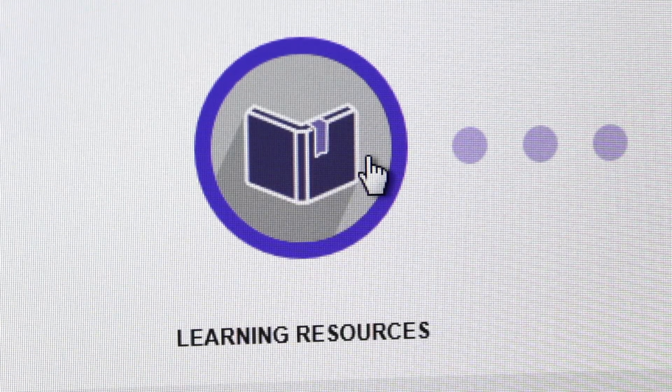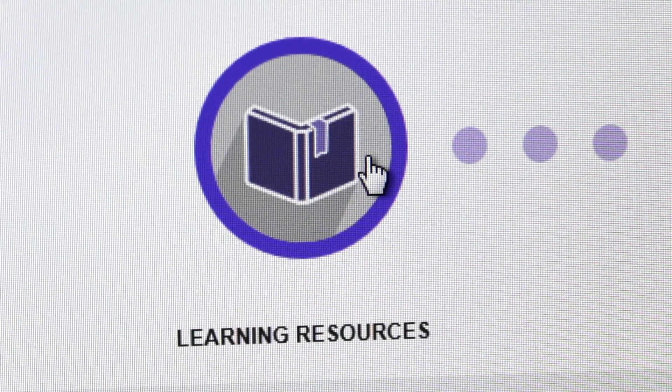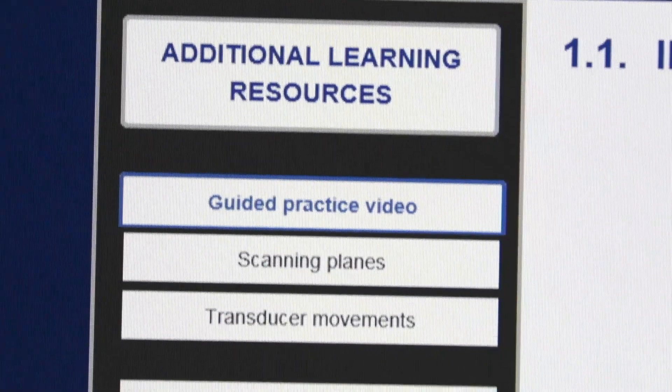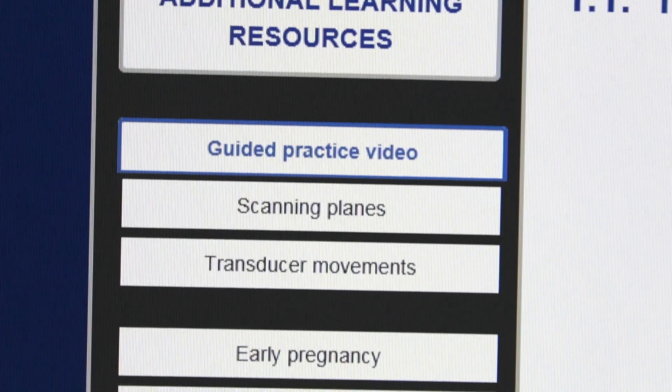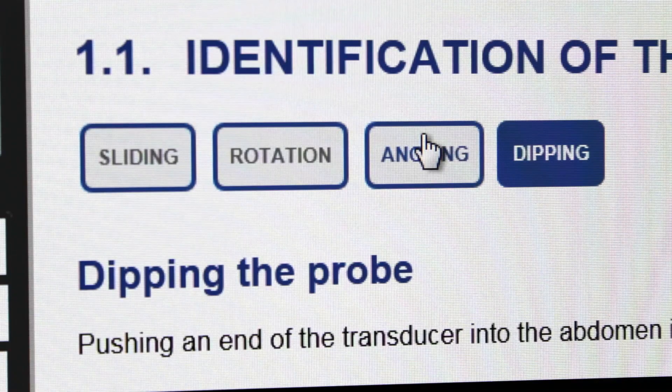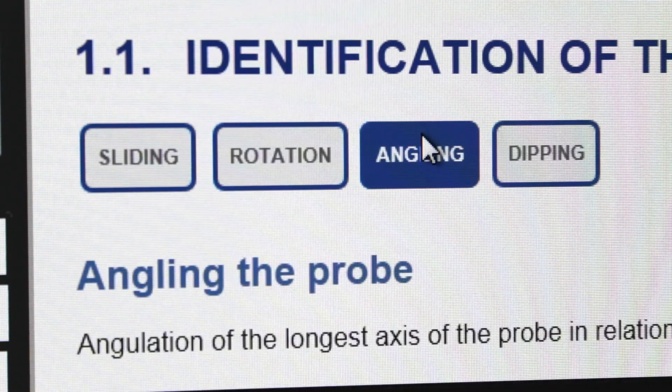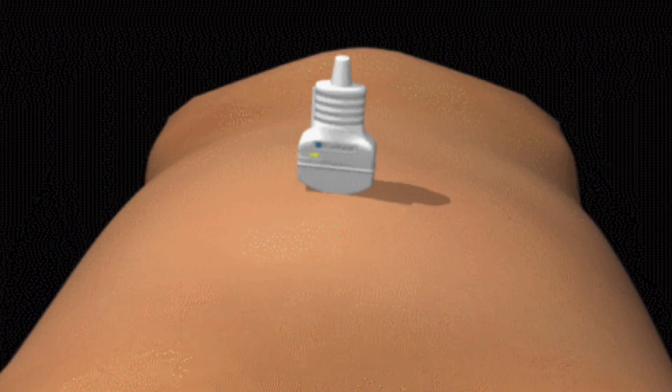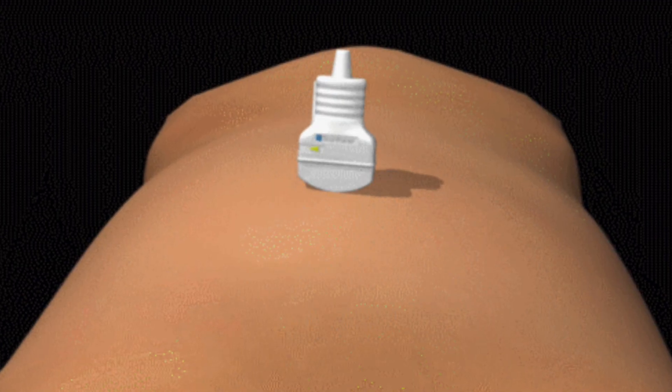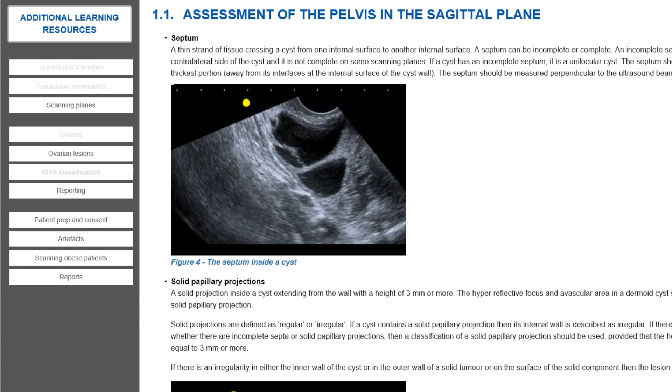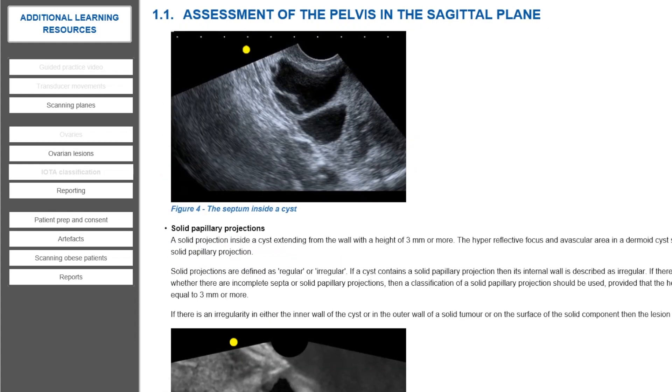The trainee can also access an extensive range of supporting learning resources, including expert videos for each assignment, scanning technique schematics, and comprehensive textbook references.